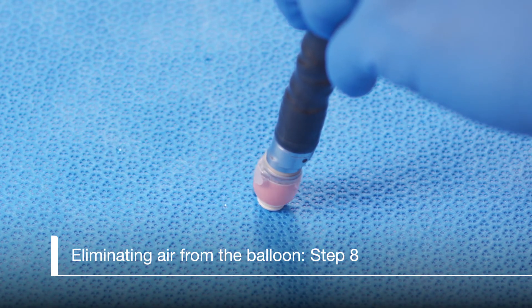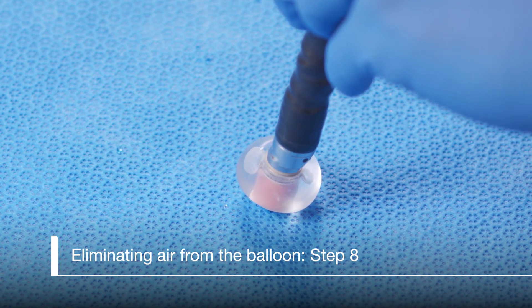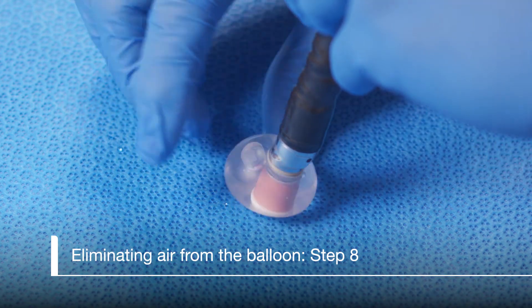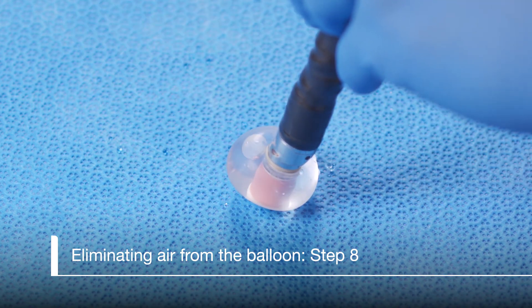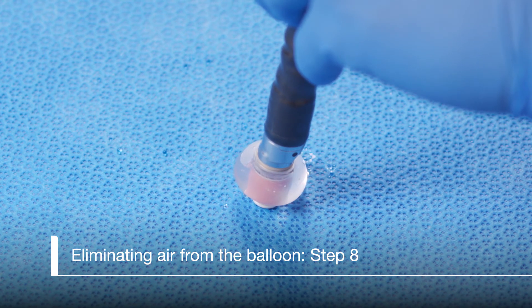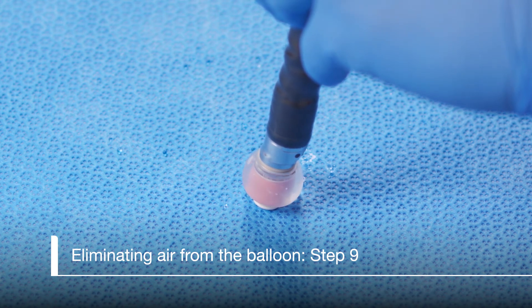Point the tip down and inflate the balloon to approximately the size of a half dollar. Now bring any air bubbles together near the suction port and aspirate them by completely depressing the suction valve button to the second stage. Continue to inflate and suction the balloon until all air bubbles are eliminated.